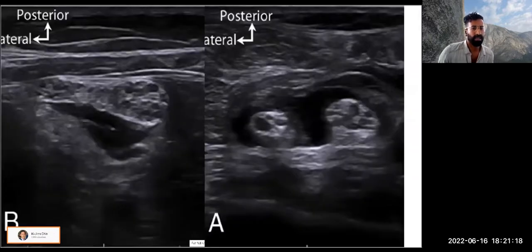Similarly, this second slide demonstrates the difference between a subparaneural and a subepimysial spread pattern with some of those points that I just mentioned. Now, with the subepimysial spread pattern, you will still get a block. And if your purpose is only to provide analgesia and you're having difficulty getting into the correct layer, and you're worried about causing needle trauma, you will still get an effective block with this. It just may take a long time for it to set in.